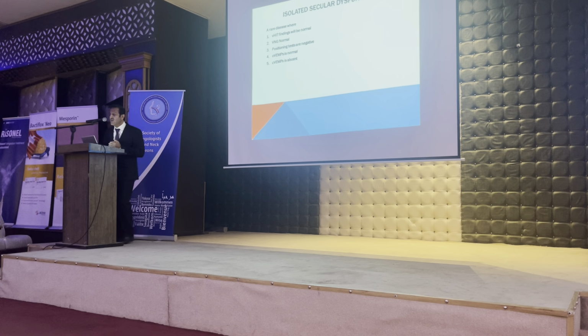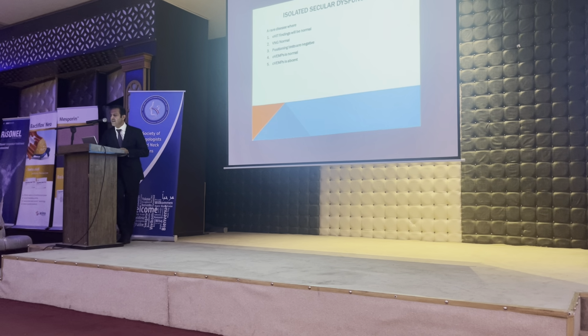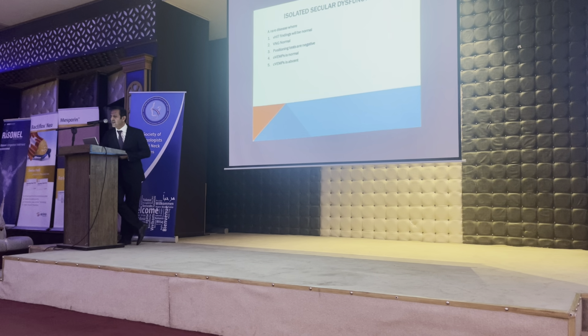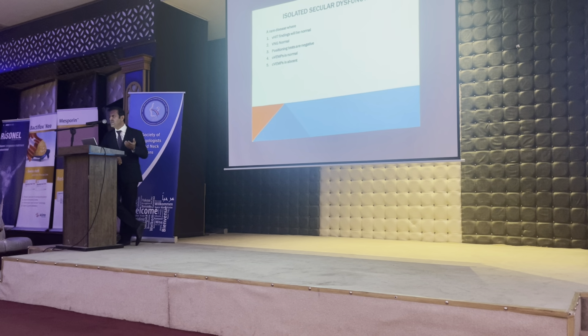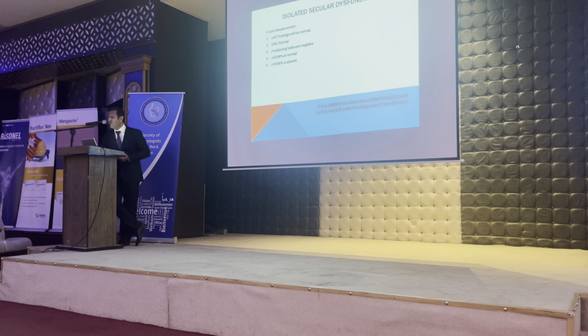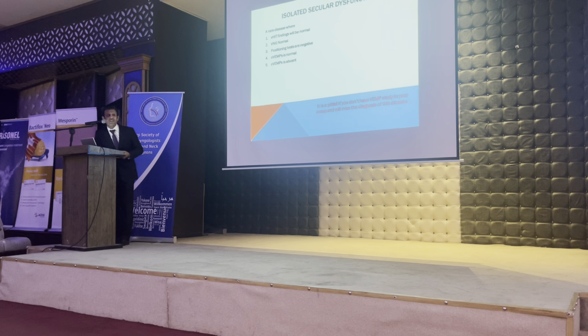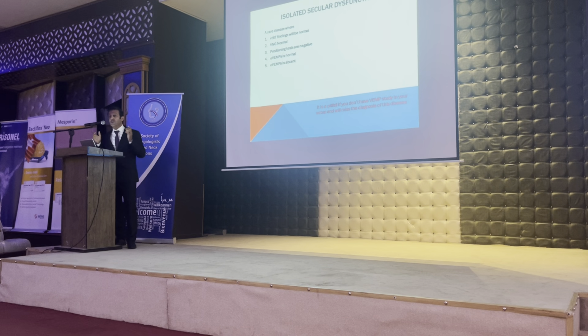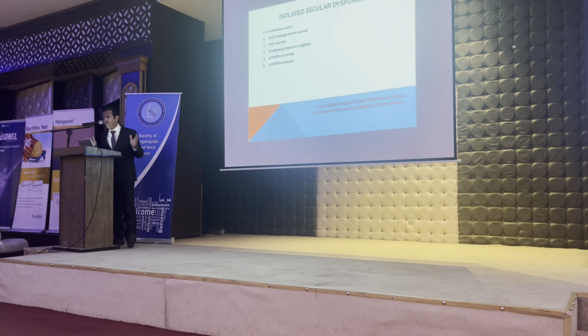Now, in isolated saccular dysfunction, a rare disease, vHIT will be normal, VNG normal, positioning test negative, oVEMPs normal, but cVEMPs is absent. So it is a pitfall if you don't have VEMP study in your setup for diagnosis of this disease. Dr. Haider, please, 2 minutes left. So if we are talking about vestibular lab testing, you need to have the full pattern. If you depend on few tests, definitely you will have a pitfall.